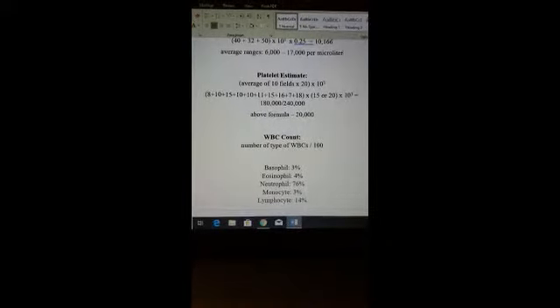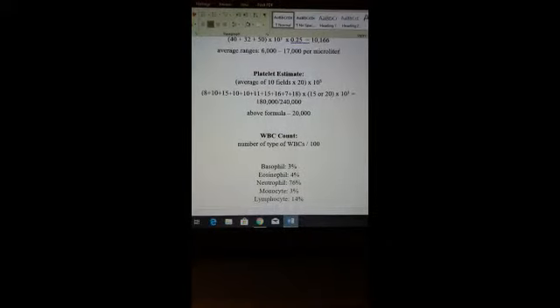We had said 16,000, it would have been 160,000, and that was subtracting the 20,000, but if we're doing the math right and going by our correct formula, it would be 180,000, which is just a little bit low. Usually a low normal for our platelets would be 200,000 per microliter.